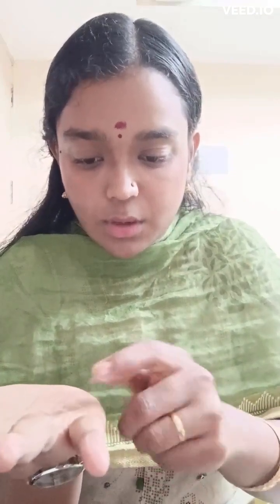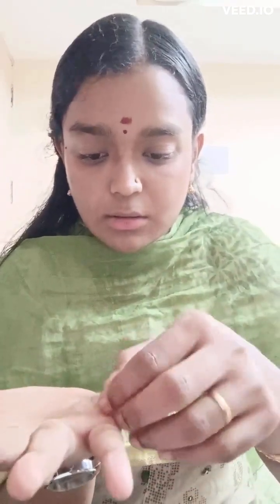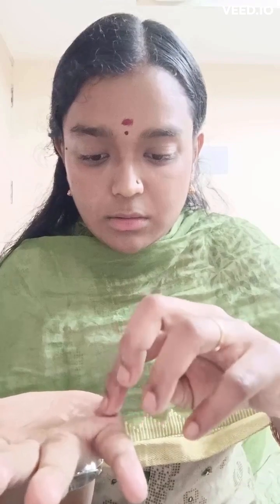To do the taco test, we have to place the contact lens on the edges. You can see it has a well-formed bowl position. So this is the well-defined upright position of our contact lens, and this position has to be maintained before insertion.